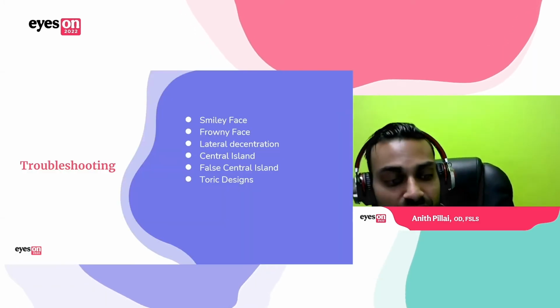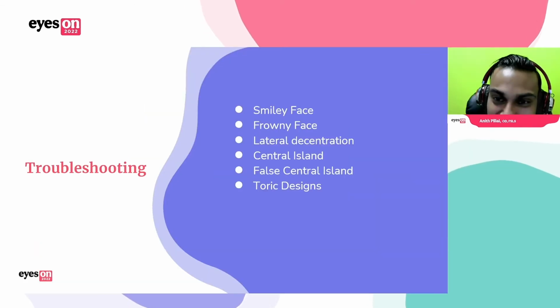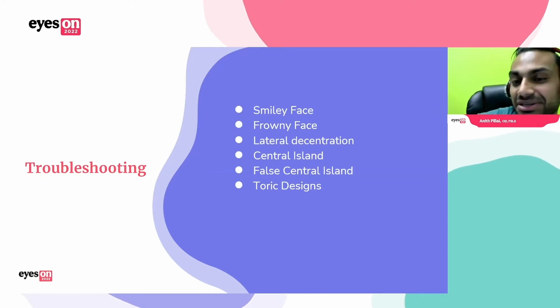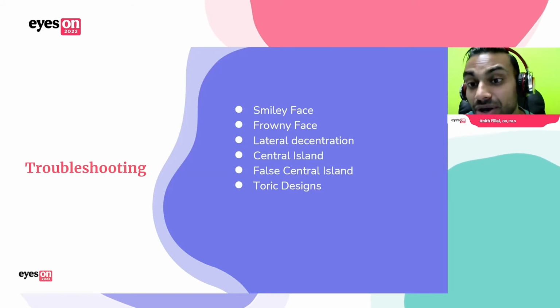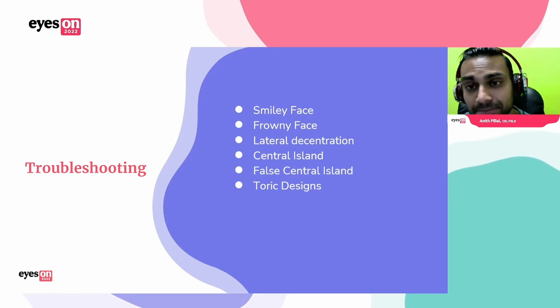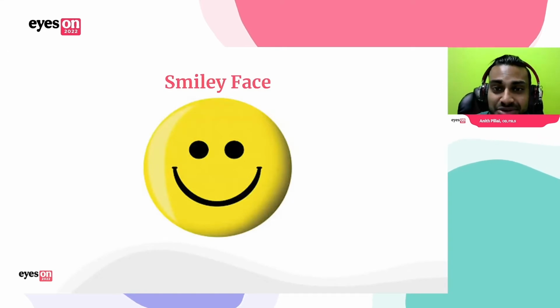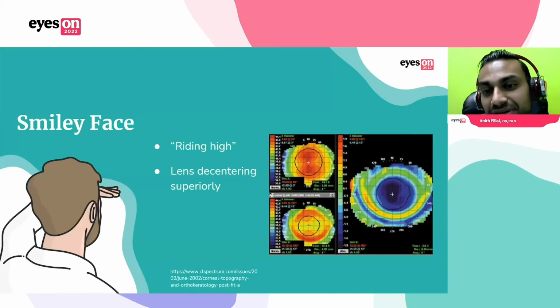Now let's get into when things go wrong. And they will. As you get better and better, you'll have fewer and fewer visits, I'm sure, but you'll encounter problems along the way. The issue is not to avoid the problems, but know what to do when they come up. So, smiley face: this is actually a term that Ortho-K docs use, the smiley face topography. And really all it means is a superior decentration.